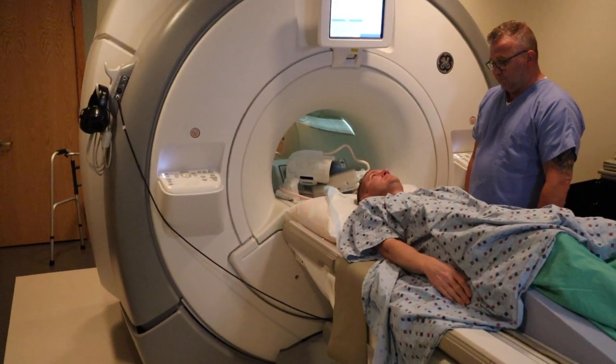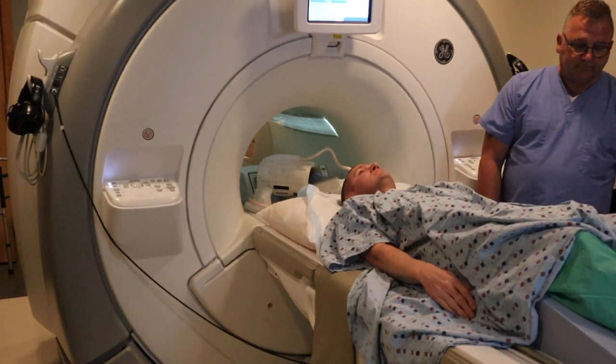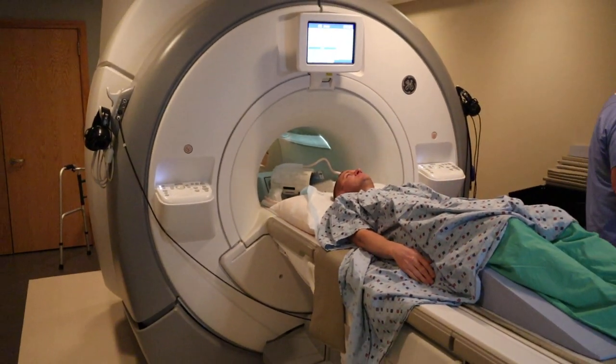The patient is going to put earplugs in, and the table is going to raise.